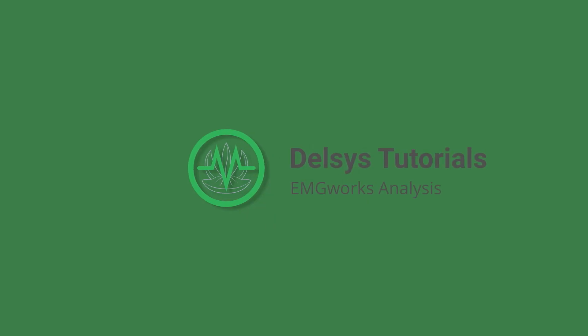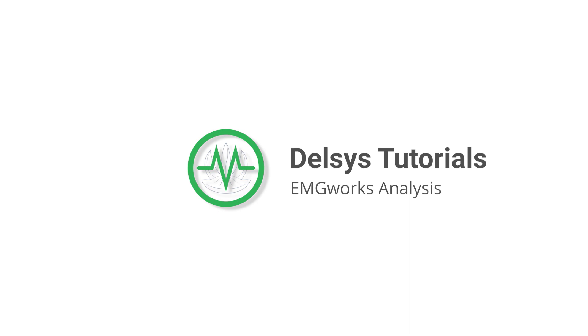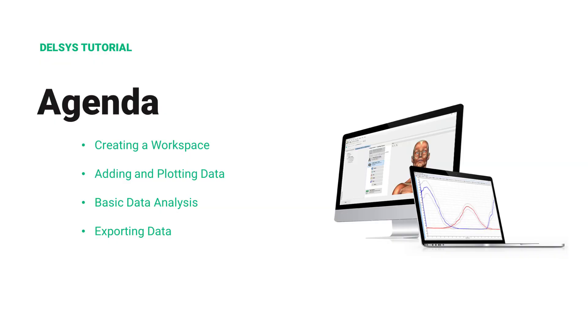This is a Delsys tutorial on getting started with EMG Works Analysis. This tutorial will cover the basics from creating a workspace through data exportation. Please follow along or skip ahead to begin.